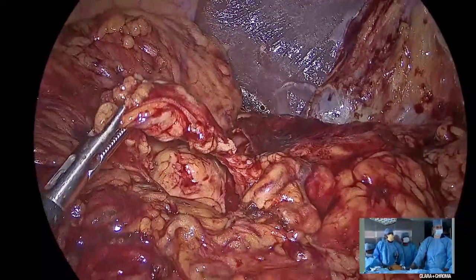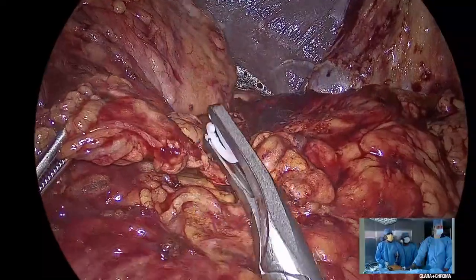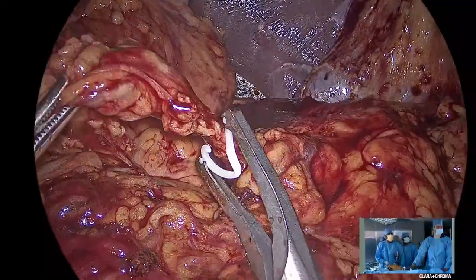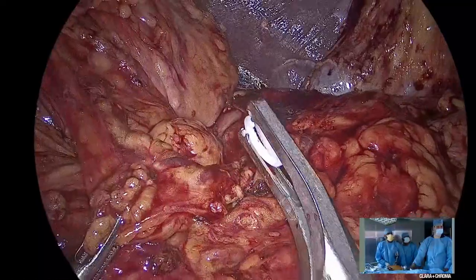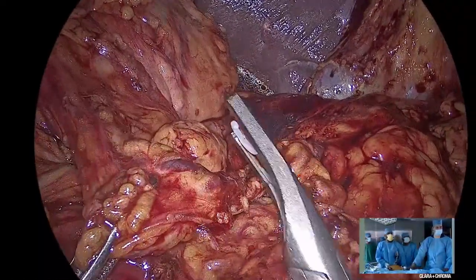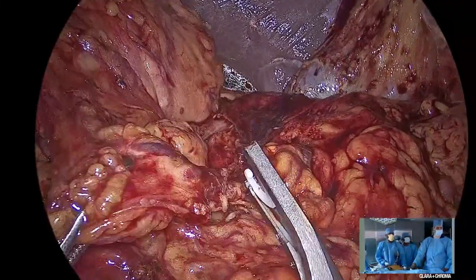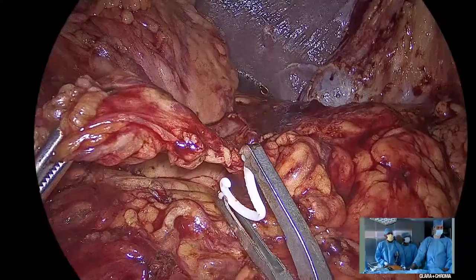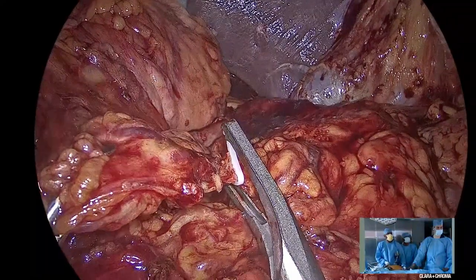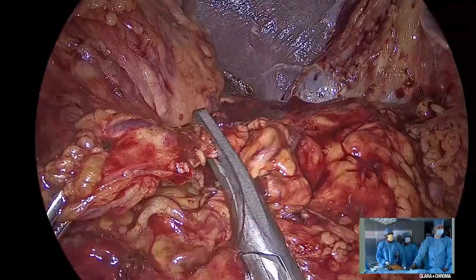Thank you, sir. So as Kripalani sir says, I was actually concentrating on this vessel, and I probably pulled it a touch too strong, and that ripped off that small vessel, whatever that was. It's probably a vessel that's branching out from here and going to the head of the pancreas, uncinate process. So we held it and we put a machine clip. So for this, I'm going to put a hemolock. That's done.